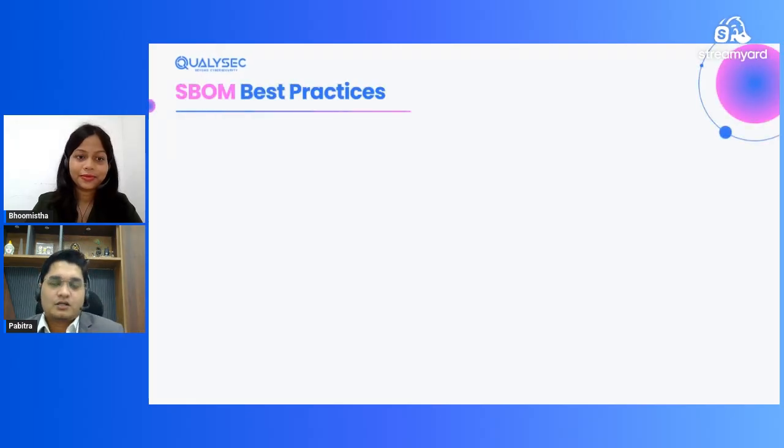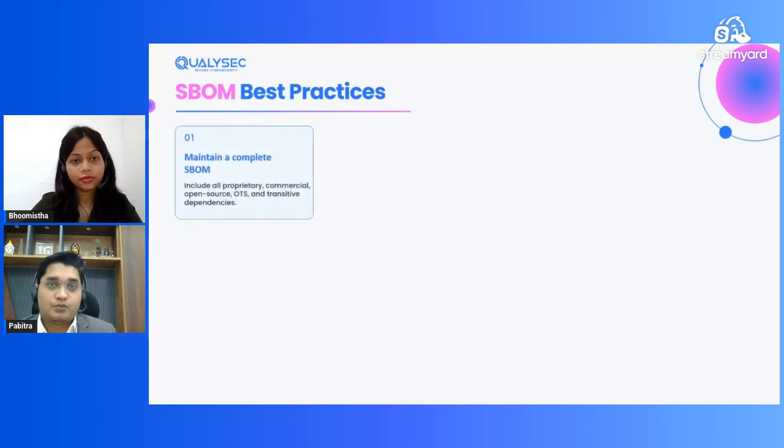So moving forward, the SBOM best practices. We know what SBOM is, why the FDA requires it, and what the components are that the FDA reviews for RTA. Then we know how to create this SBOM and what components it takes, and how it helps in SPDF. Now the most important part is the best practices, the common practices we follow so that we make sure our SBOM report is FDA ready.